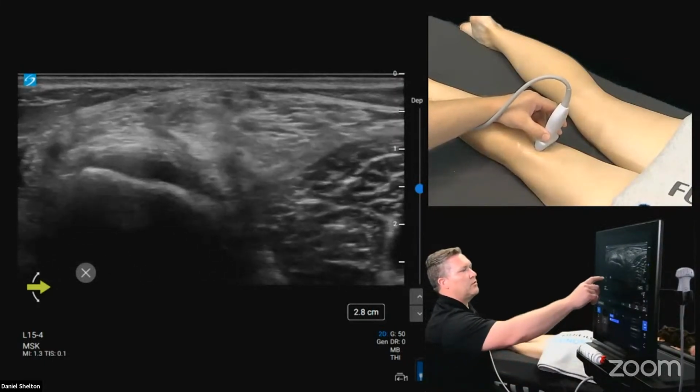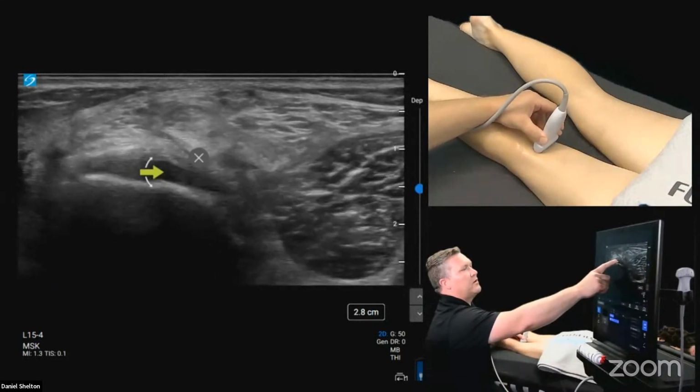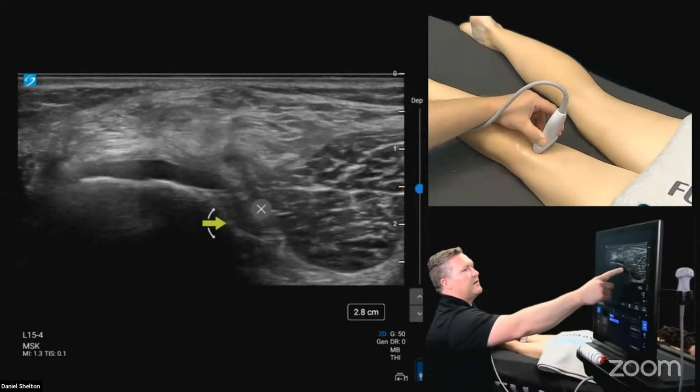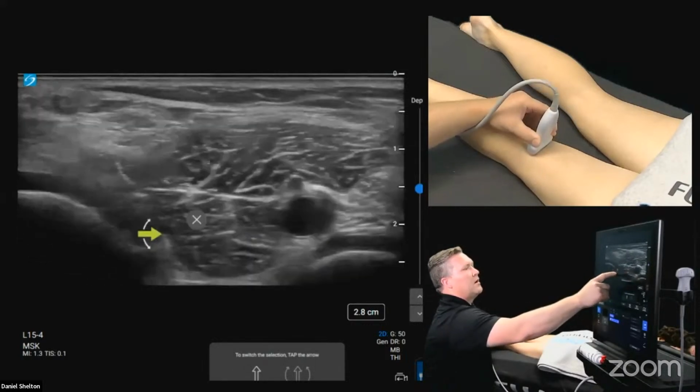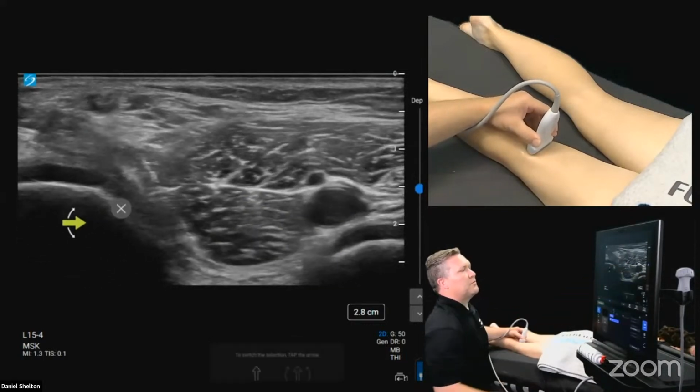And that's what we have here. So this right here is the articular hyaline cartilage. I should be able to follow that valley down and see one on the lateral side too. So here's the lateral femoral condyle, not to mention our neurovascular structures, which we'll get to next.